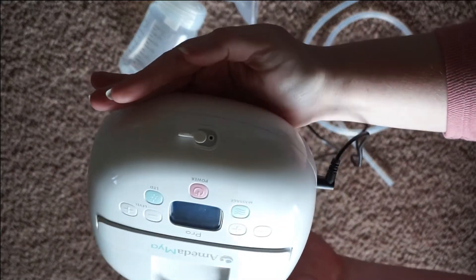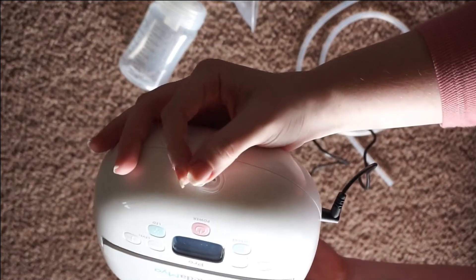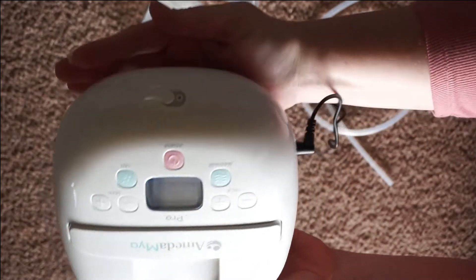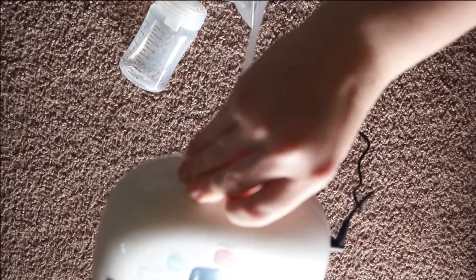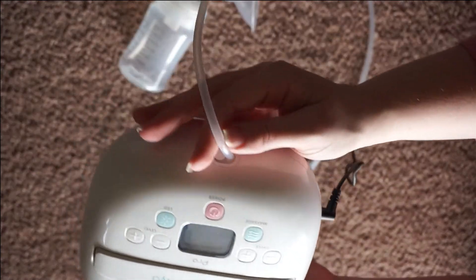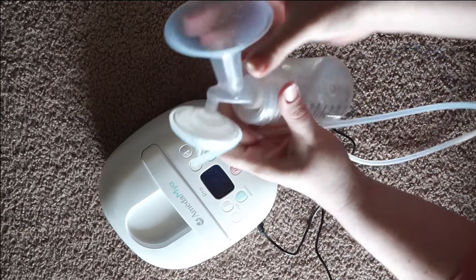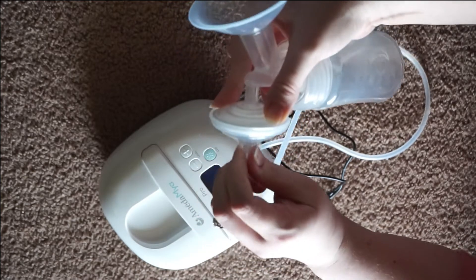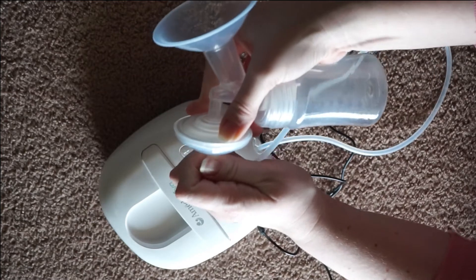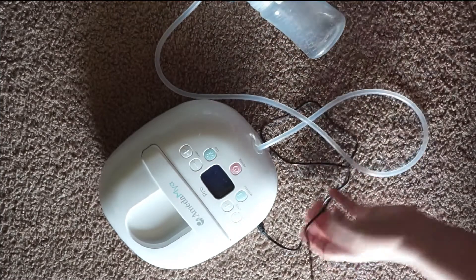I am going to be showing you a single pump version. If you want to double pump, you would just open up this flap and put the other tubing right there. But if you want a single pump, just make sure this is closed so you're getting good suction. Go ahead and take your tubing and kind of twist it — this tubing port is at an angle, not completely parallel with the pump, so you will notice it kind of goes up. Take the other end and put it right there on that little piece we talked about. I give it a twisting motion while using my other fingers to press against, so nothing's snapping off and nothing's getting too much pressure on it.